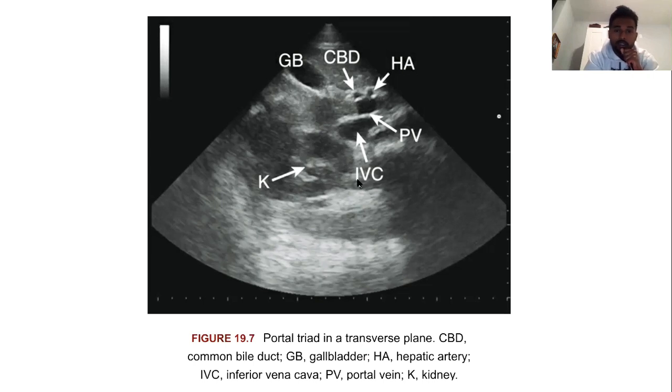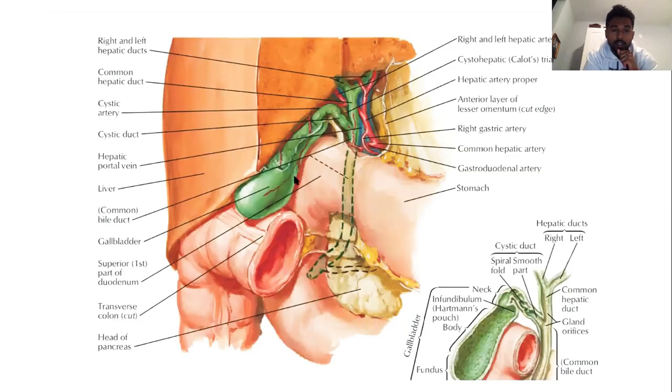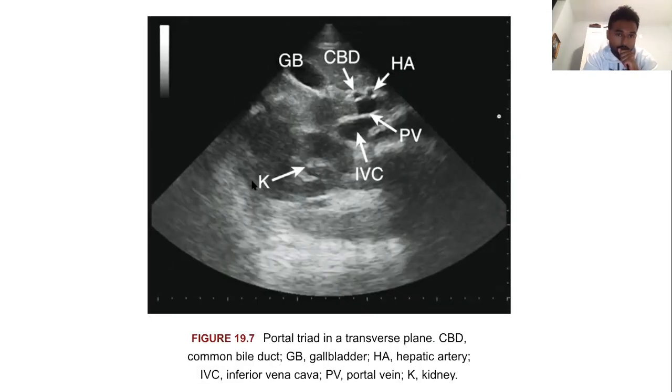This is what I was saying. Look where the kidney is. You see how close the kidney is right here to the liver and the gallbladder? Oh, K is for kidney. It shouldn't be there, right? This is where you lose your resolution and the signal gets deeper. The kidney is no way that close, right? And this is the gallbladder. Does that make sense to you now?